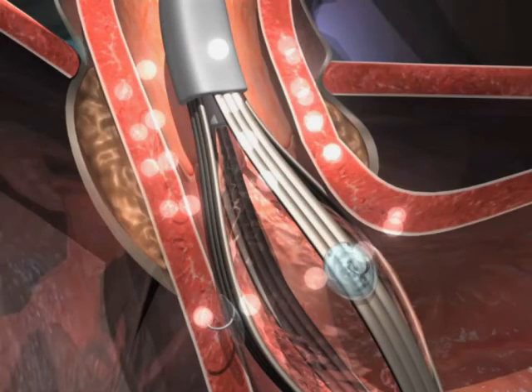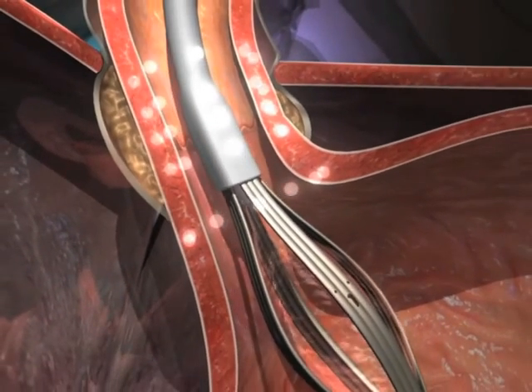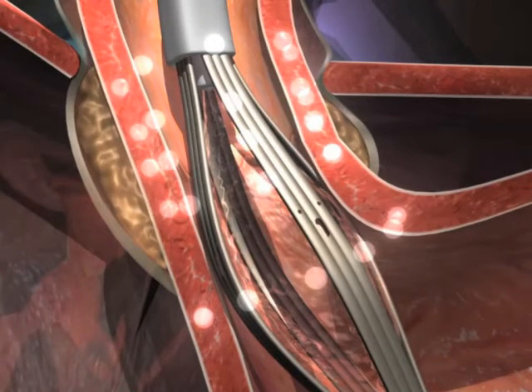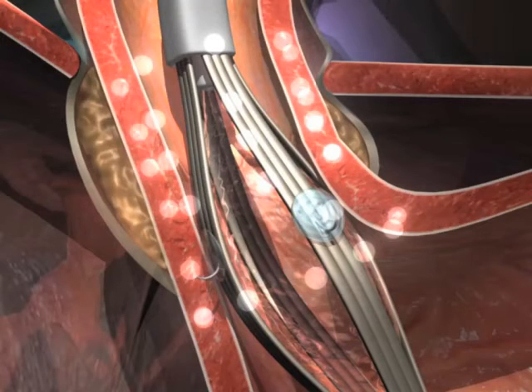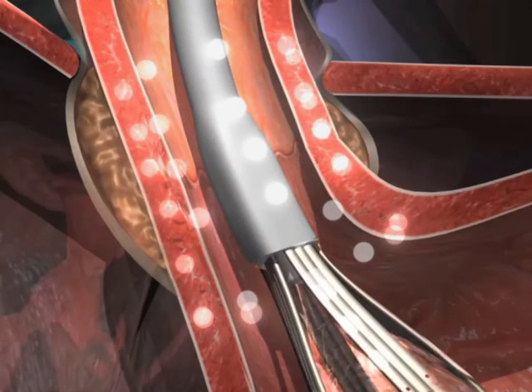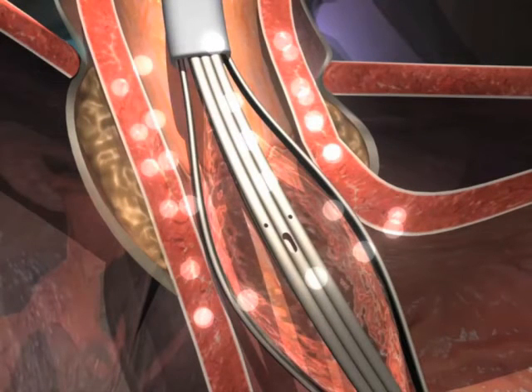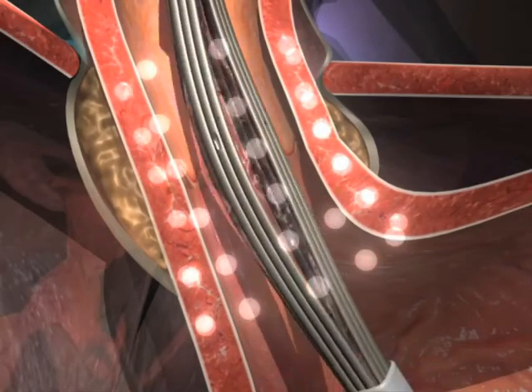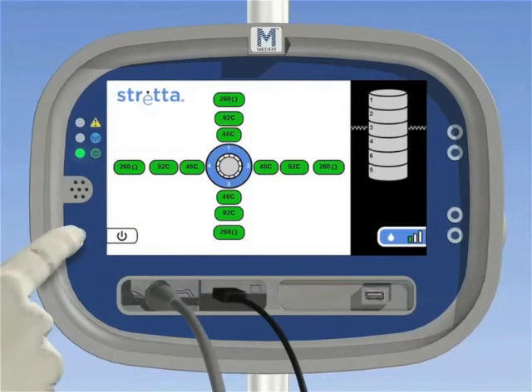For treatment level 6, retract the needles and advance the catheter again into the fundus of the stomach. Deflate the balloon to 22 milliliters. Withdraw the catheter slowly until resistance is felt — this should be above treatment level 5. Extend the needles and deliver the first treatment cycle. At the completion of this level in the gastric cardia, retract the needles, advance into the fundus, rotate 30 degrees to the right, pull back to the identical treatment level, extend the needles, and repeat the treatment. Then repeat at 30 degrees to the left of the initial treatment. Once all treatments are completed, it is important to follow the instructions for generator shutdown.